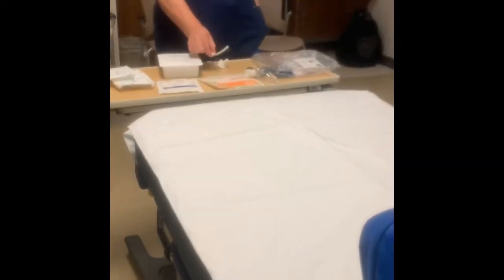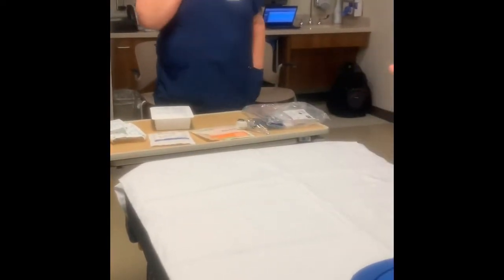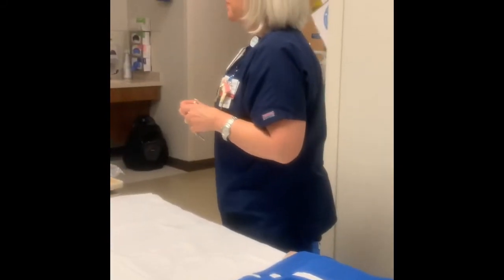What do you think you need here? An obturator, if they're inpatient. Thank you for that. Okay, so I need my obturator. So you can give me this trach tube here because I think this one's a different size, okay? What else am I gonna do?